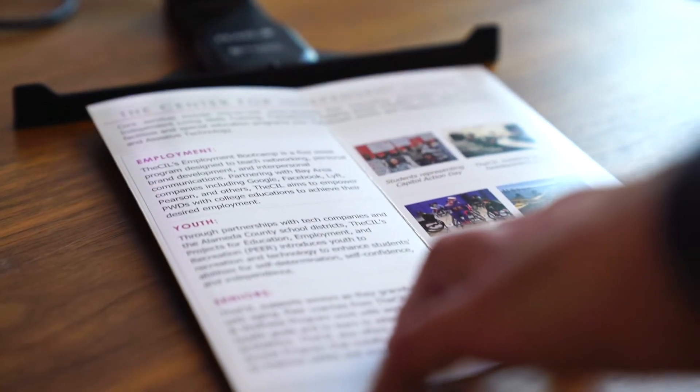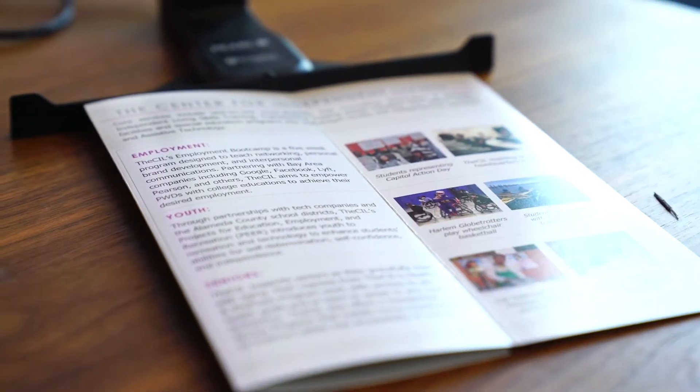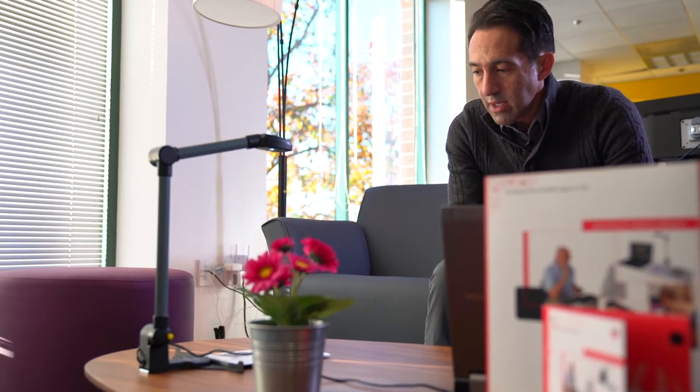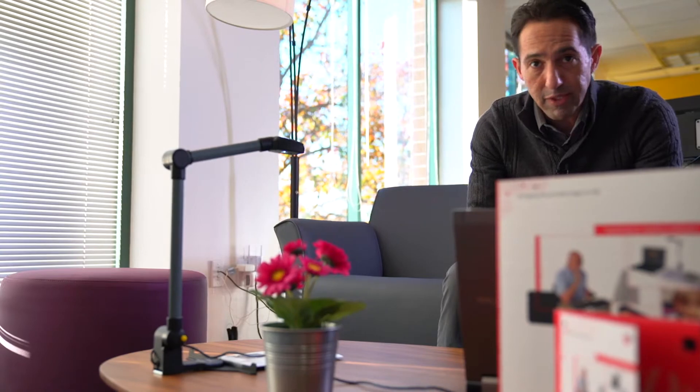Alright, so here we go. We have the Open Book software all ready to go on the computer. The computer's set up, our camera's set up. And I'm just going to put in our first document, which is our CIL brochure or pamphlet, some information about the CIL. I'll place it right under the camera right there. And then I'll press the space bar to get the snapshot. And we'll hear what Open Book does with this first document.